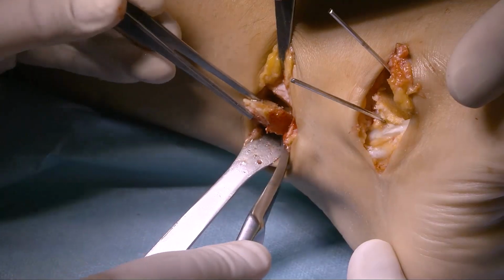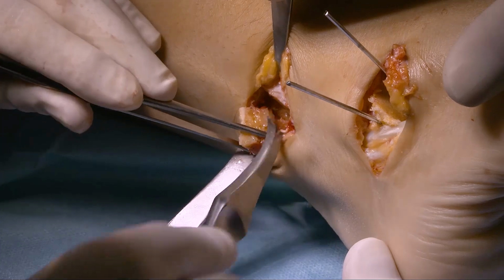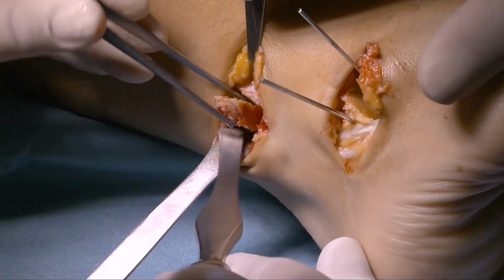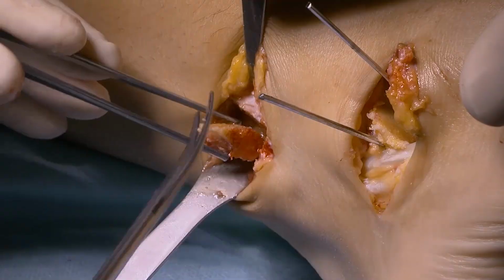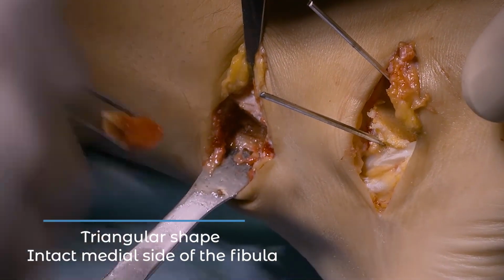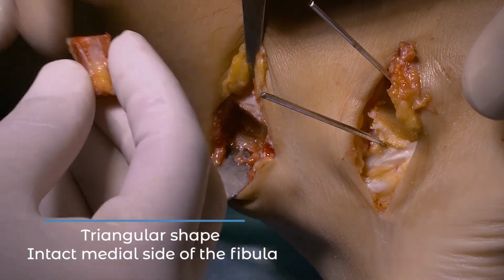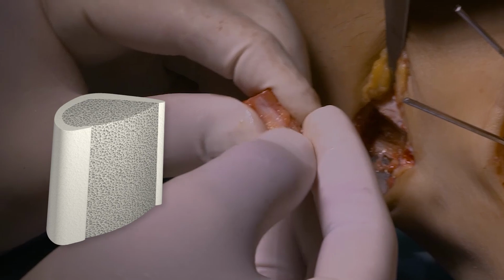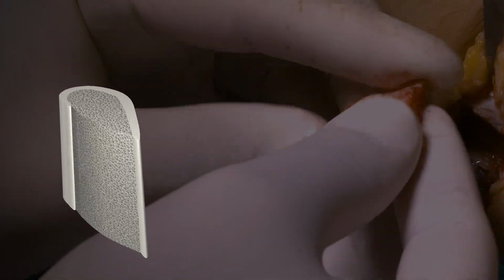The harvested fragment has the shape of a triangle. It also has a strong cortical layer. It's a bit like the bone graft we take from the iliac crest.